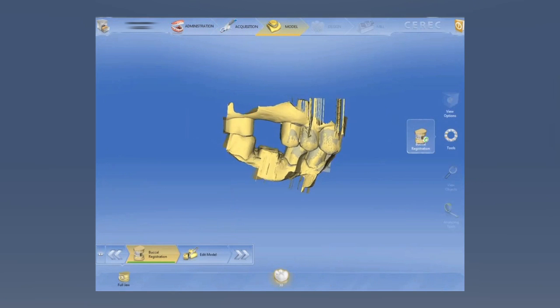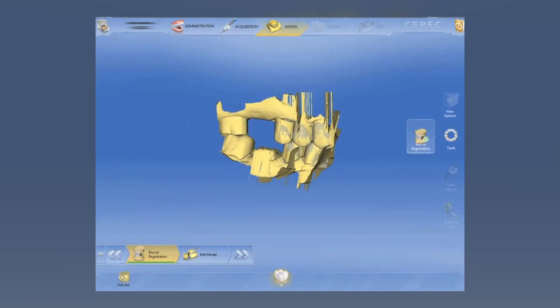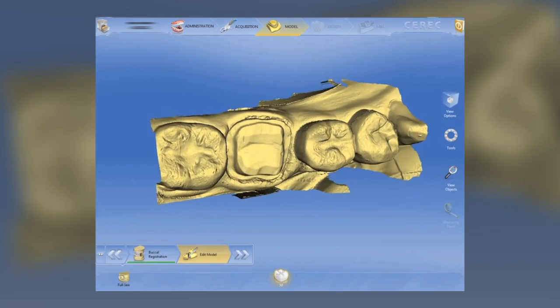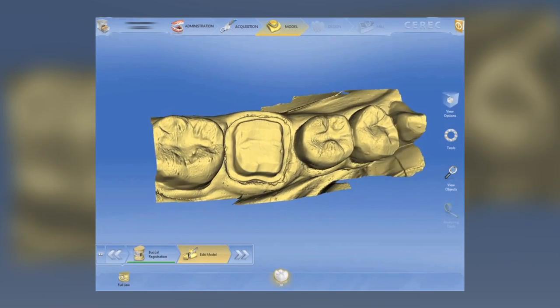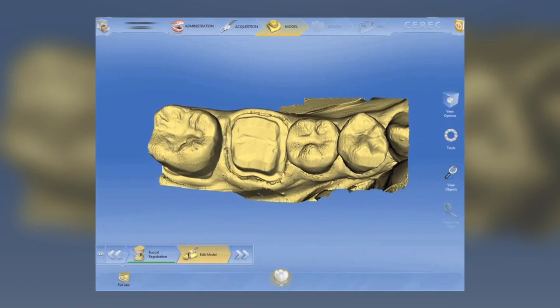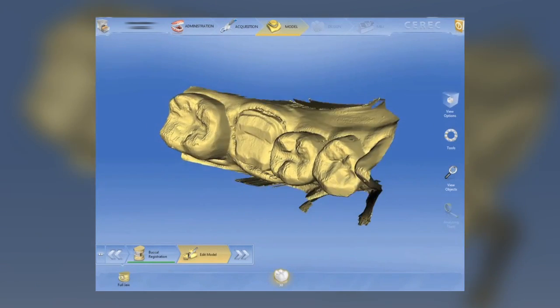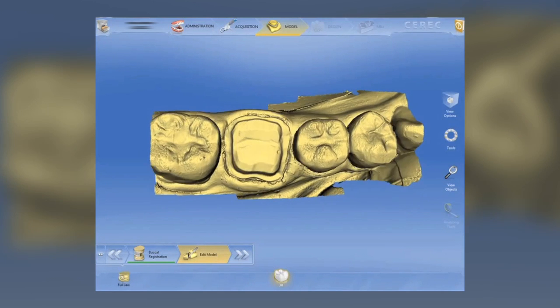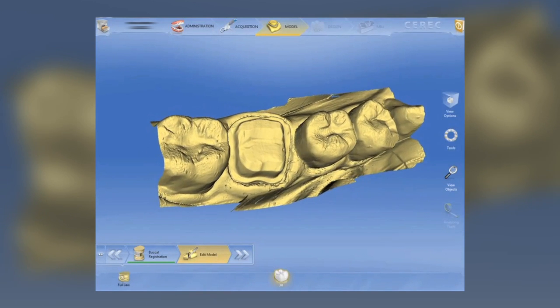Here we have the buccal bite matching, and again this is pre-release software, so you're not going to see the nice clean models that you will in the end, but they do look much, much better than they did before.